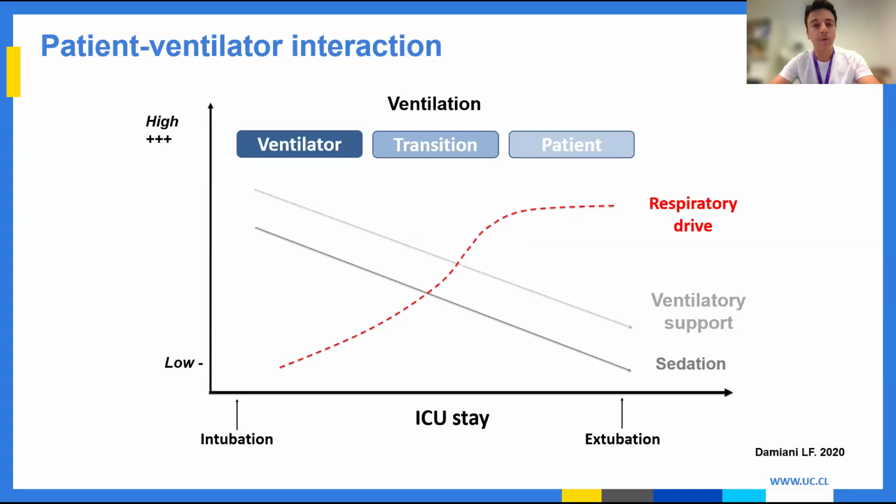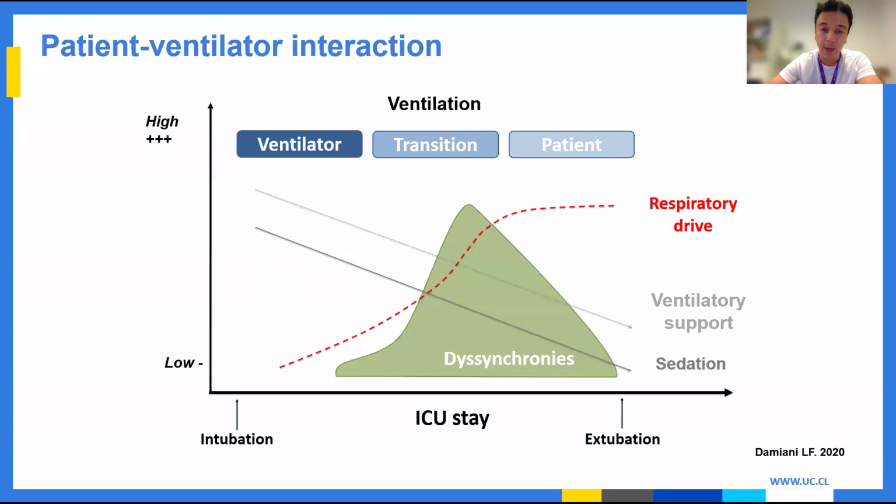This is so important because during passive mechanical ventilation, we are used to learning different concepts of mechanics, and it's a little bit easier. But when the patient starts to awake and tries to breathe with the ventilator, things are more complex. We have different types of patient-ventilator desynchrony, and that's why monitoring the effort is really important.